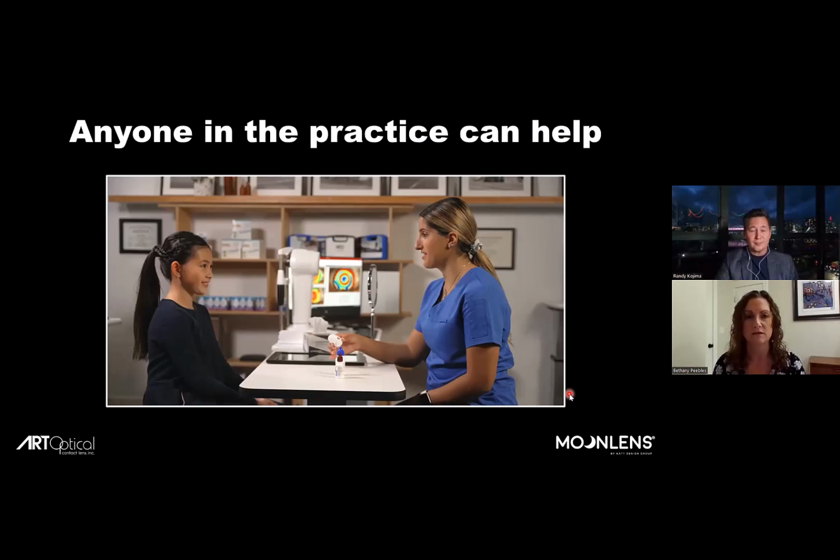And like you said, the technicians can do this portion of it as well. So I really think utilizing your staff to their full potential is really helpful and going to save practitioners time. So having it be very user friendly, very straightforward, you really can get everybody involved at the office and maybe take some of that off of the practitioner. Like you said, they're still going to obviously need to be the one evaluating the outcome and looking at topographies, but being able to do those small details and processing the order and not have to do it themselves, I think that that's a great tool.